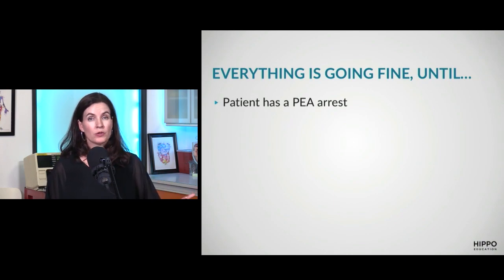Guys, what's your approach to this patient? What are you going to do first? CPR. I intubated their esophagus. Oh, yeah. So I'm going to bag them up. You're going to bag their esophagus up? No, I'm going to bag that. I'll take out the ET tube or look to see it's there and try bagging them up. Okay, so you're going to check that your endotracheal tube's in place. That's pretty legit. Paul's starting ACLS. I would do that too.